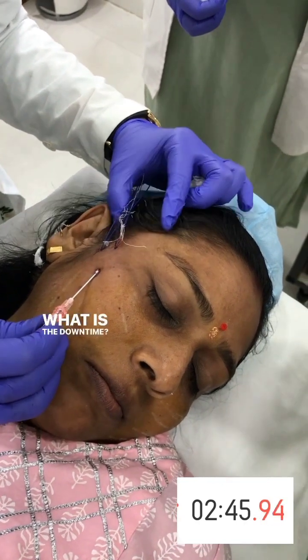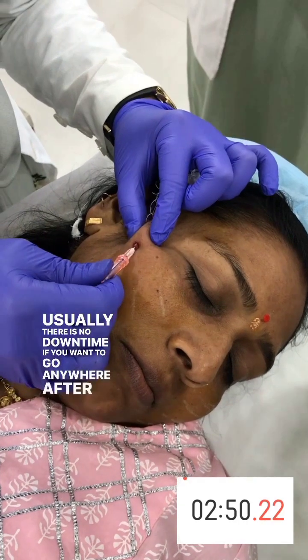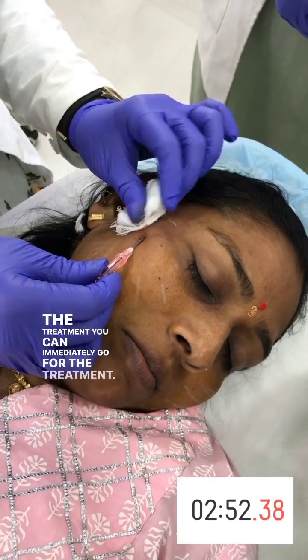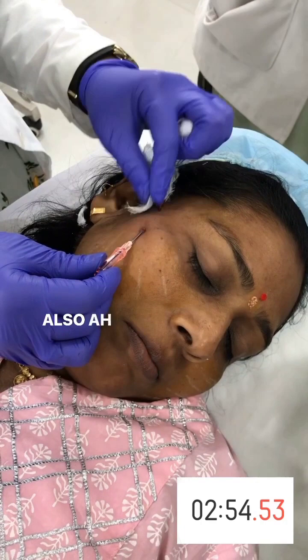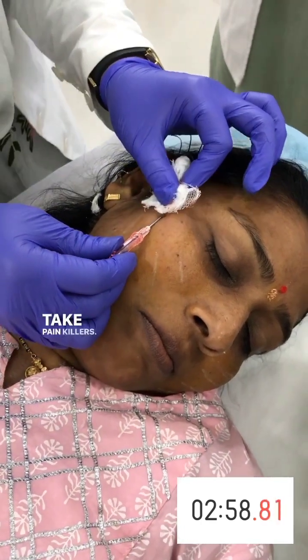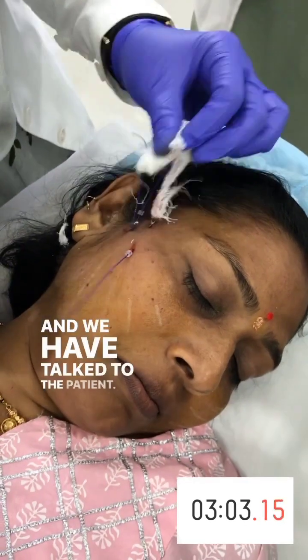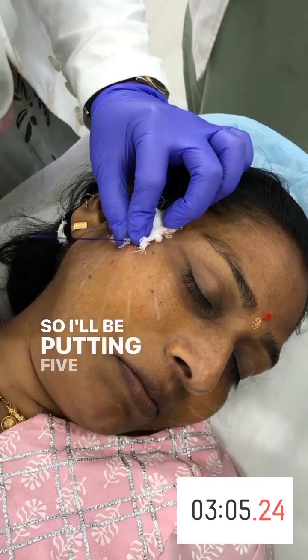What is the downtime? Usually there is no downtime. If you want to go anywhere after the treatment, you can go immediately. There will be some dull aching pain; if you take painkillers, we just modify the treatment plan. We have talked to the patient and modified the treatment plan, so I'll be putting 5 extra threads.